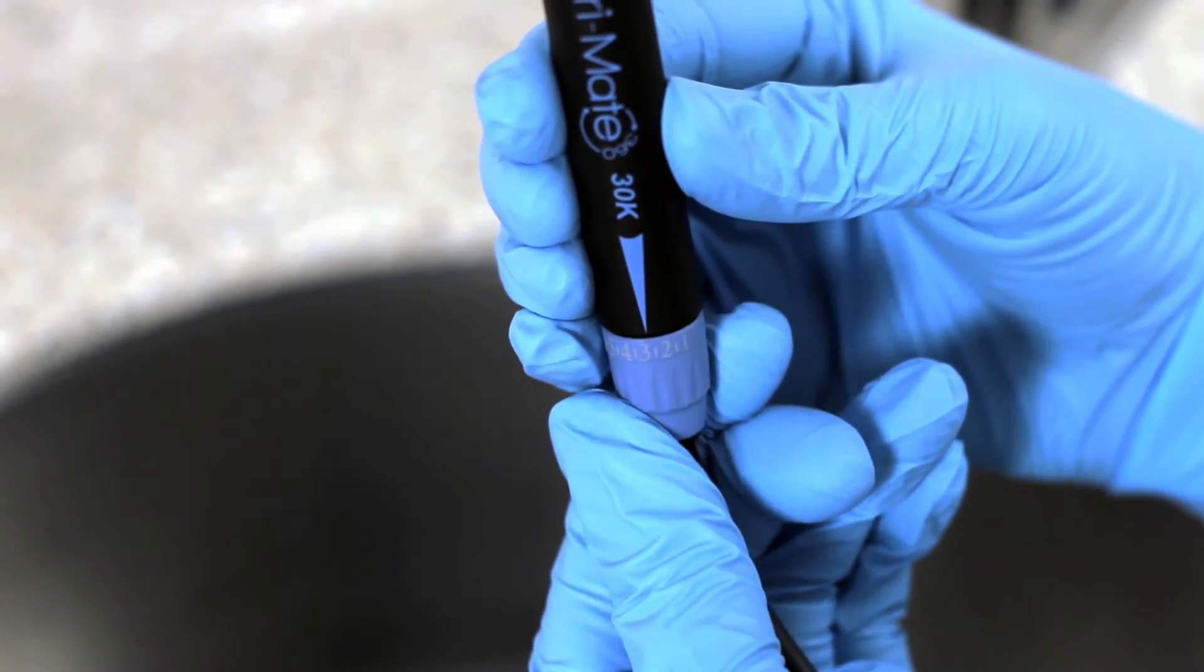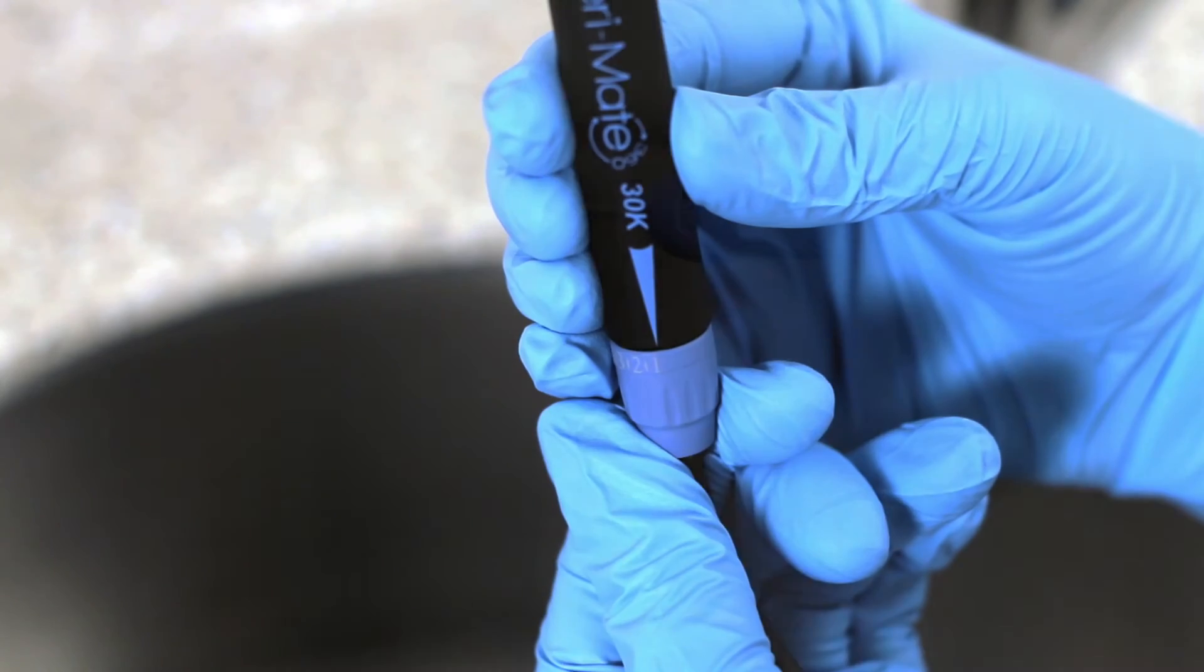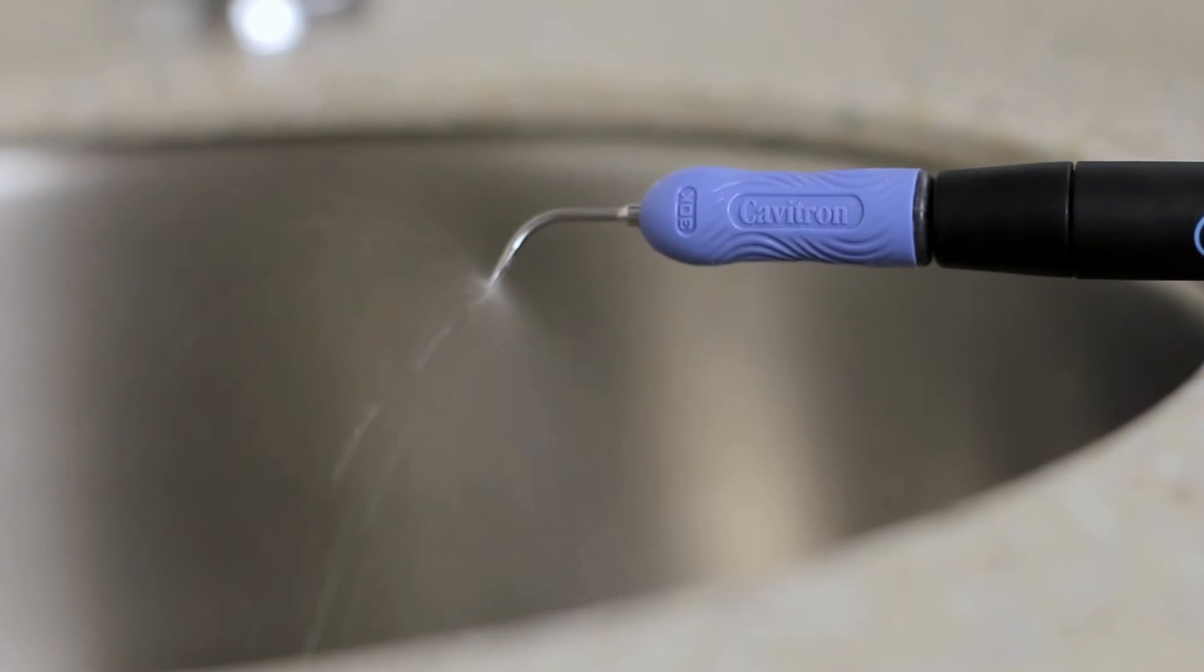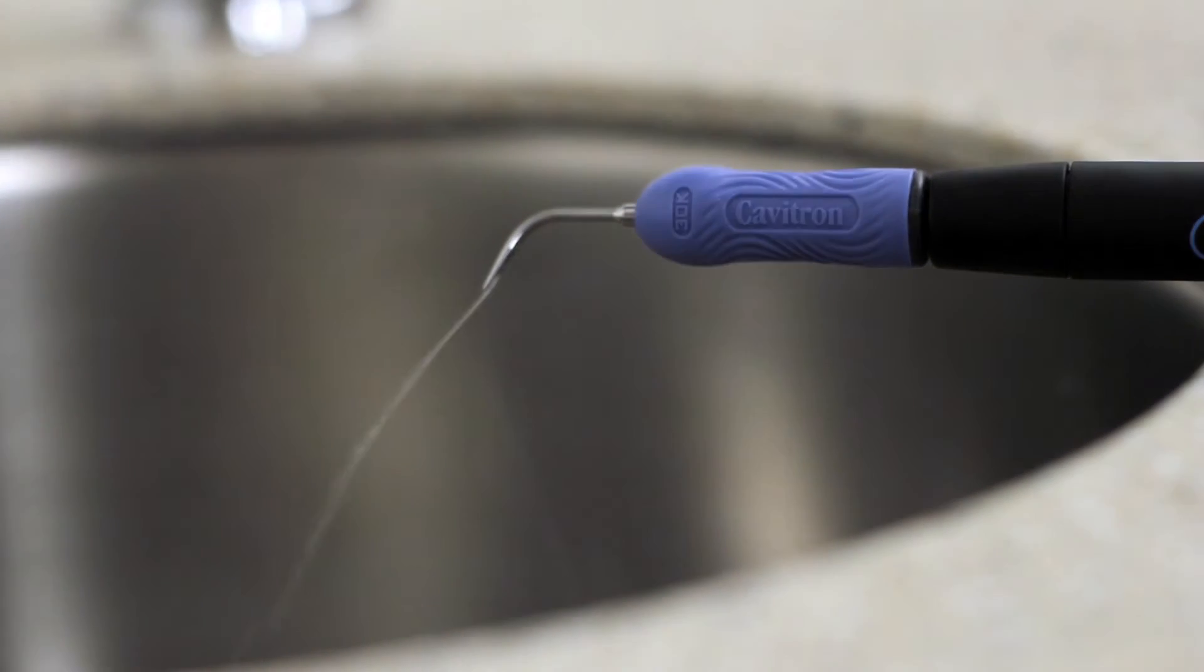The flow rate through the handpiece will also determine the temperature of the lavage. Lower water flow rates will produce warmer lavage. Higher flow rates produce cooler lavage.